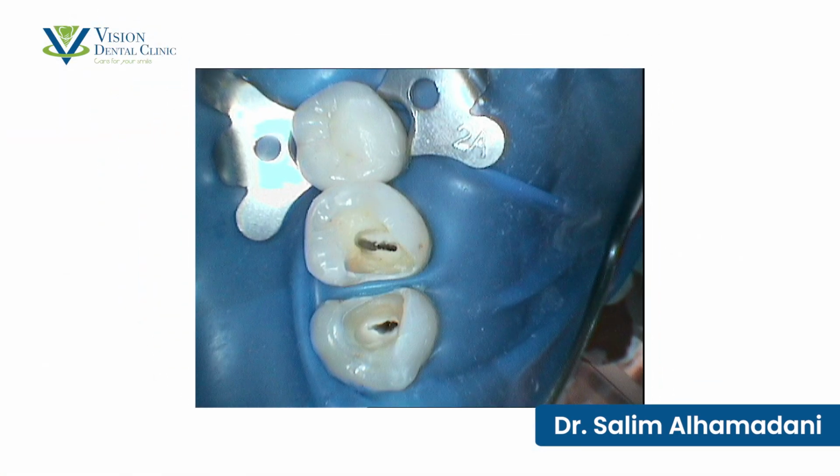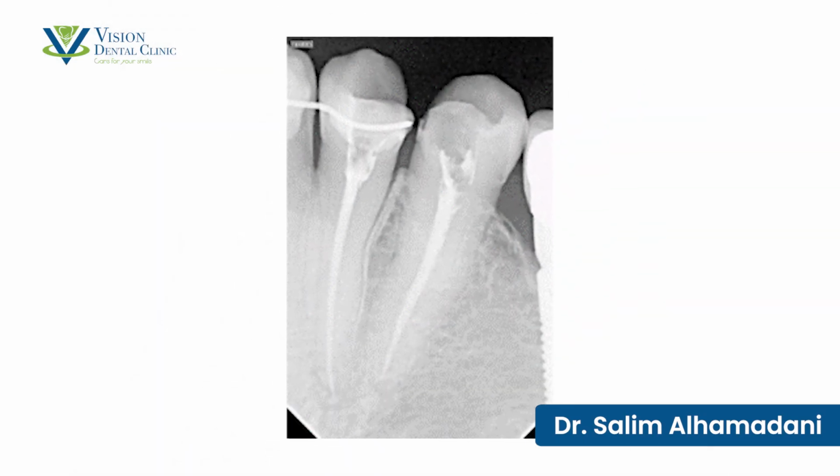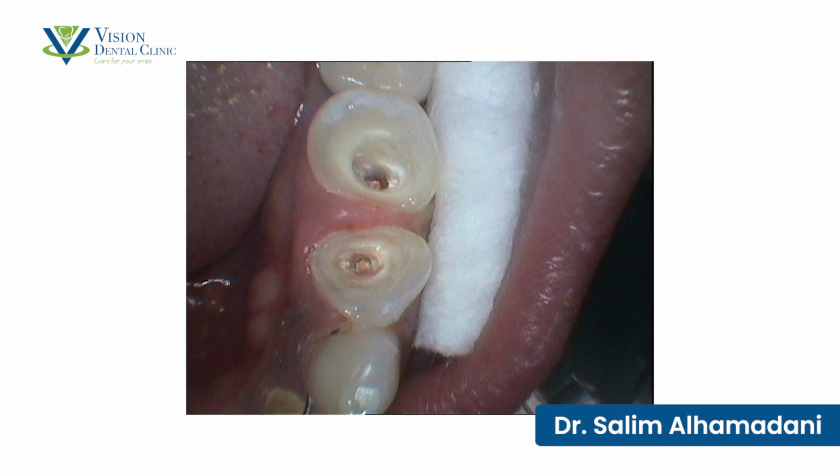Root canal treatment was done under high isolation to prevent contamination. Then the teeth were prepared with full caries removal and a lot of smoothing to receive a high-quality CAD/CAM restoration.